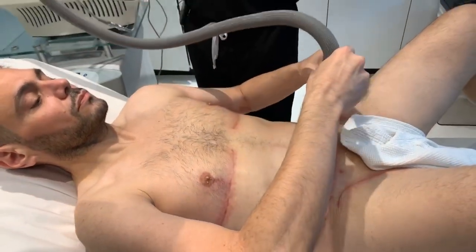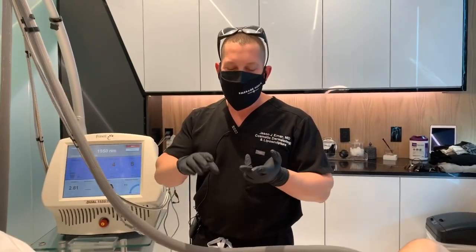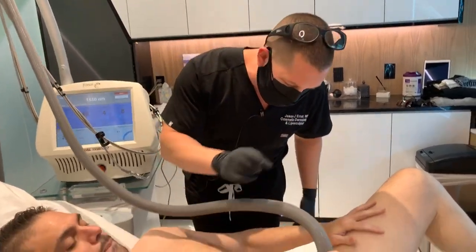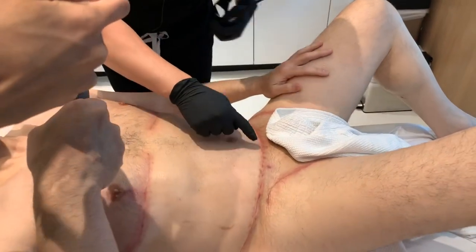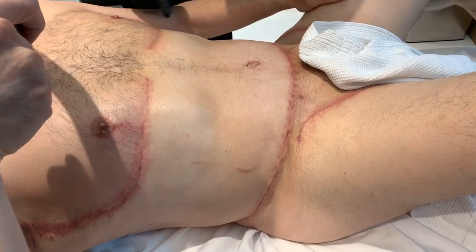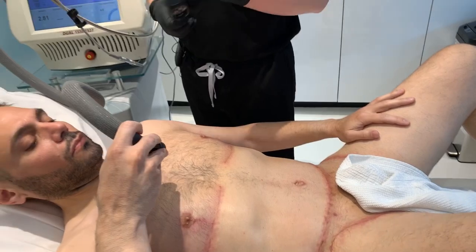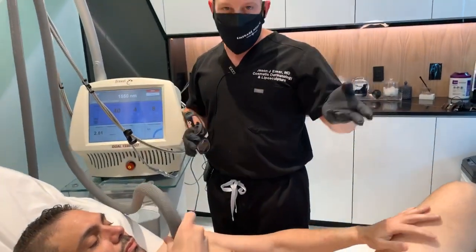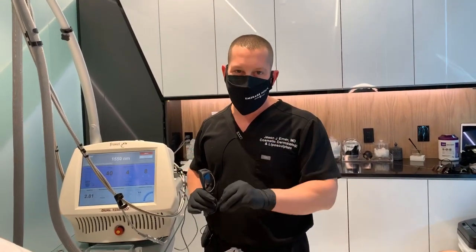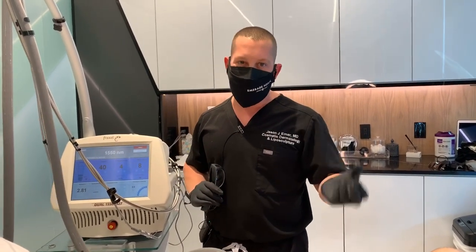If you don't laser early enough, 3 to 6 weeks after surgery, the scars can hyperpigment, they can thicken and form webs. They don't form as good of a result. So you see, like, look, right now it's getting really slim and thin. But by doing this, all these little outside areas, all this will tighten and it will blend so much more. So it's truly important. That's why I thank him for showing you guys the importance of doing lasers after cutting surgeries, after traumas, burns, etc., because this would give you a better outcome.